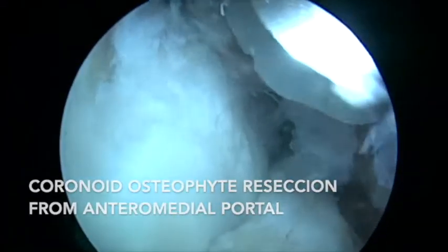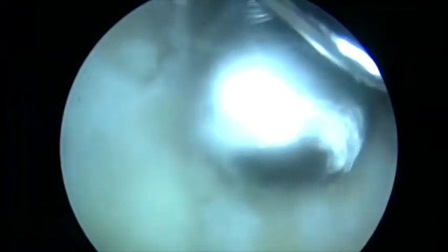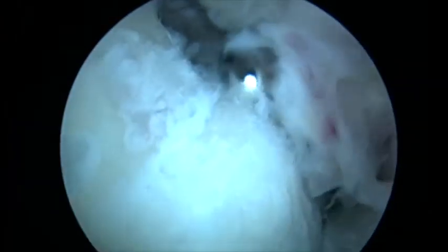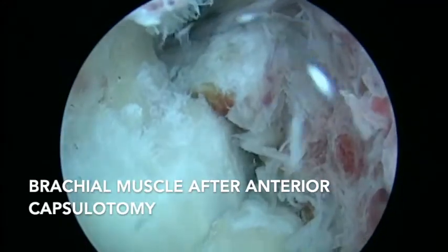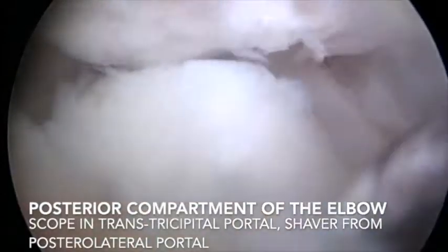We then placed the scope in the anterolateral portal and used the burr from the anteromedial portal to resect all the osteophytes of the coronoid and the coronoid fossa. You can see the fibers of the brachialis muscle after the capsulotomy.